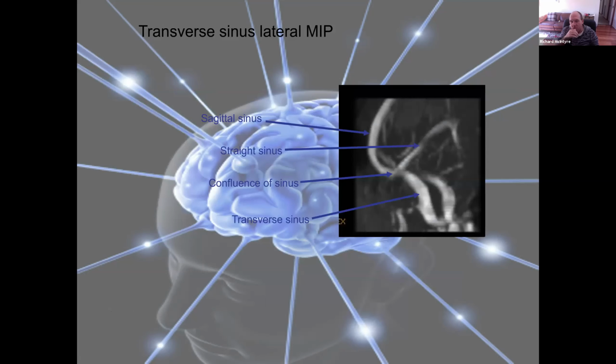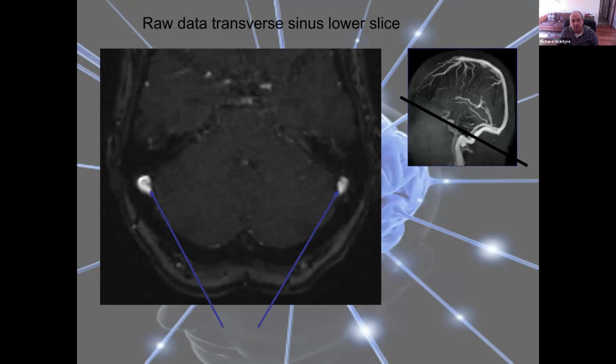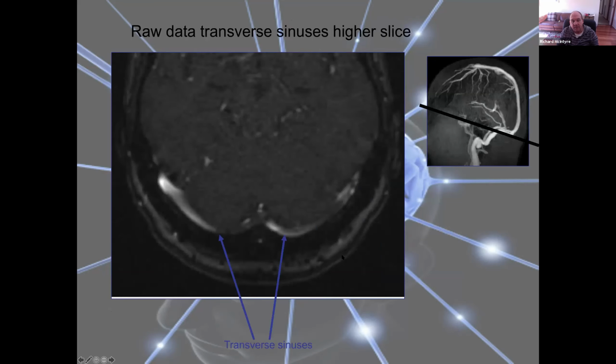And another lateral maximum intensity projection. Okay, so one slice, there's our transverse sinus.